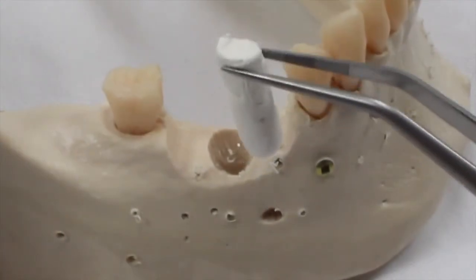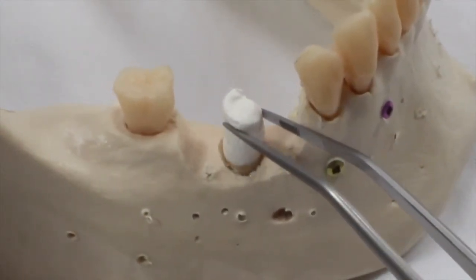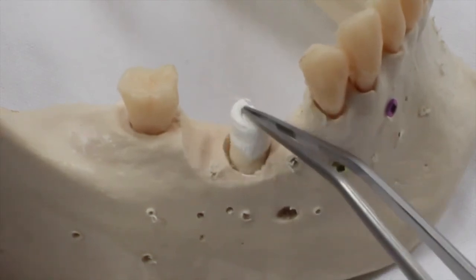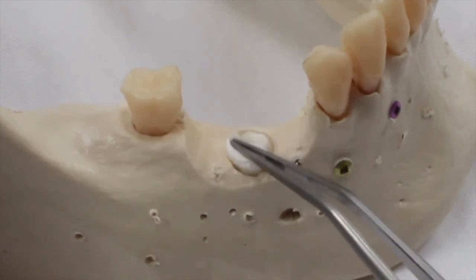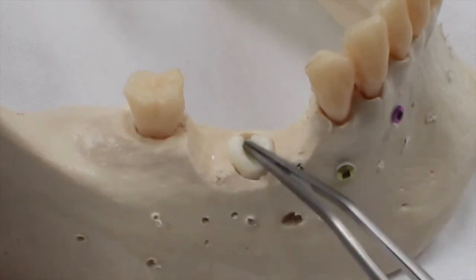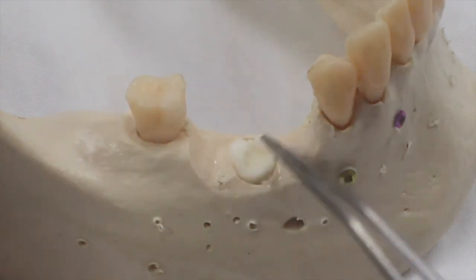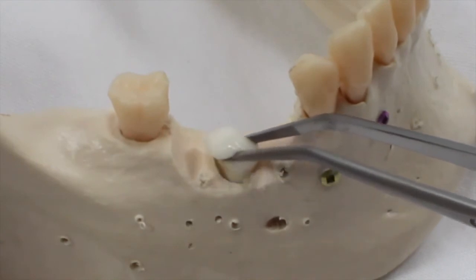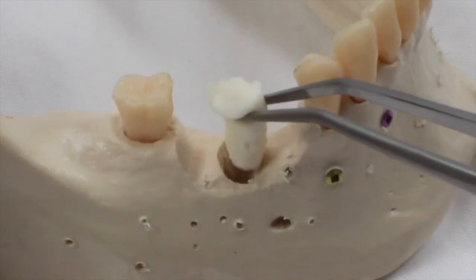Place the OsteoGen plug into the socket and let it absorb blood. Just crisscross suture over top to retain it into the socket. Here, we remove the OsteoGen plug to demonstrate that it has conformed to the root shape, but still retains enough strength so it does not fall apart as it is manipulated.